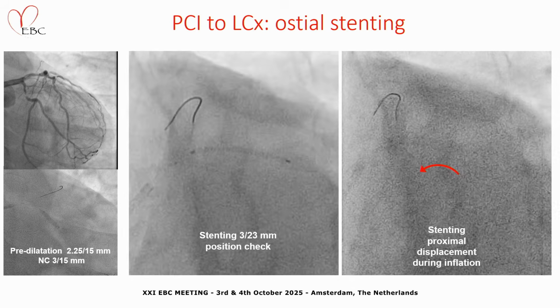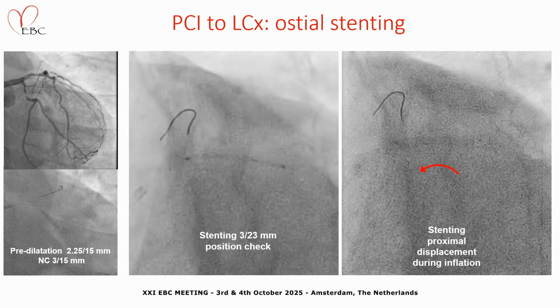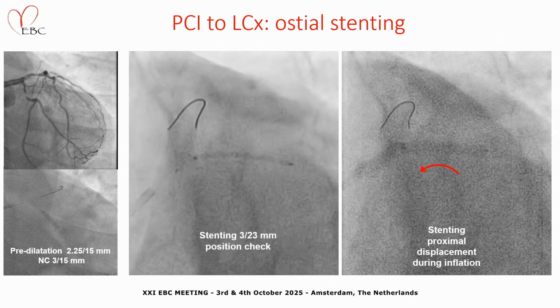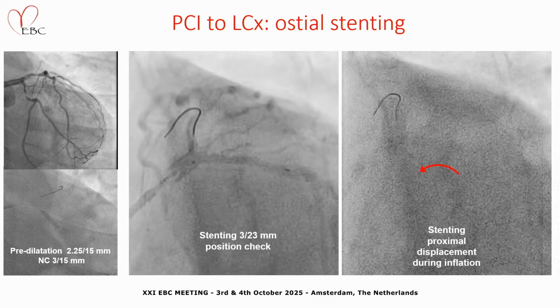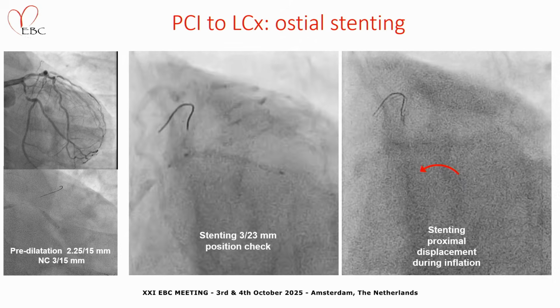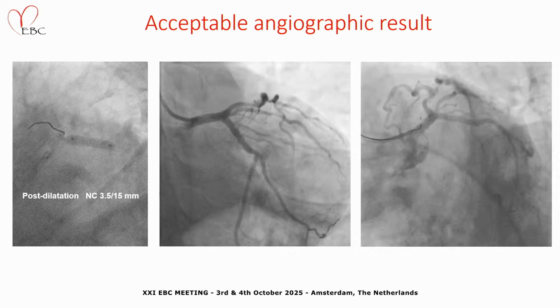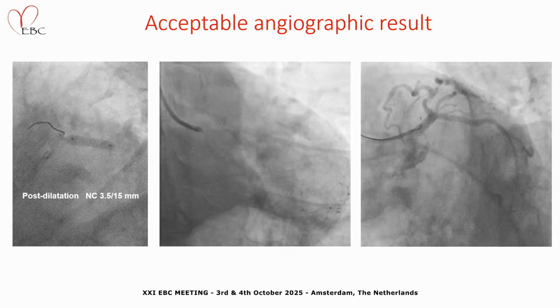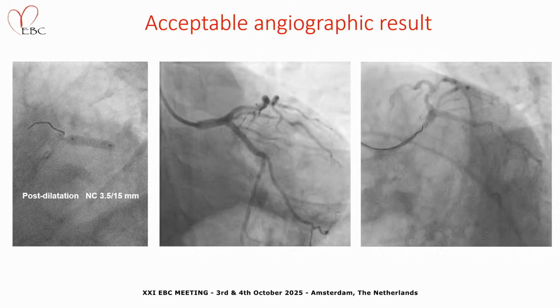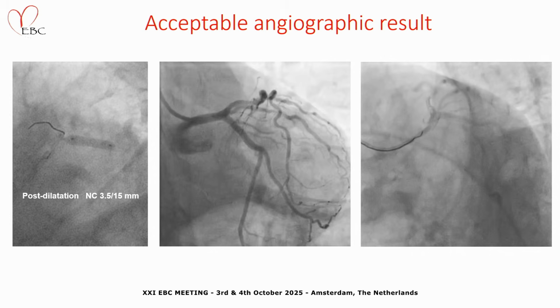And actually, during the inflation from this position, the stent was displaced even more back into the left main. So you can appreciate that the marker was more proximal than the ostium of the LAD. Anyway, the operator decided to post-dilate, and according to the angiographic result, he was happy about that. He didn't check in any other way with intravascular imaging and so on.